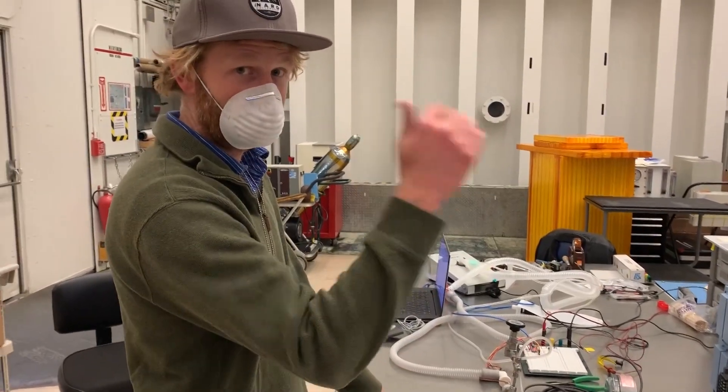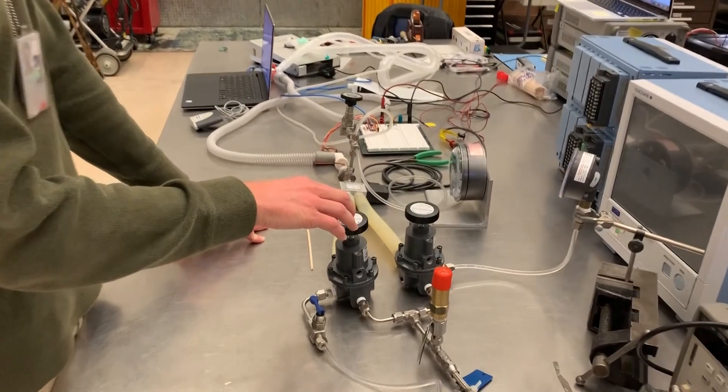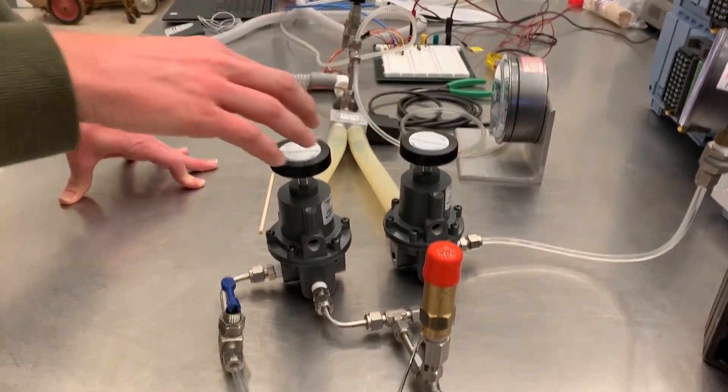On a ventilator, you have a peak pressure, which they call PIP, and a low kind of offset pressure that they call PEEP. So this is our PIP valve. This is our PEEP valve.